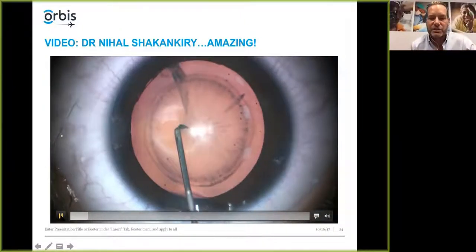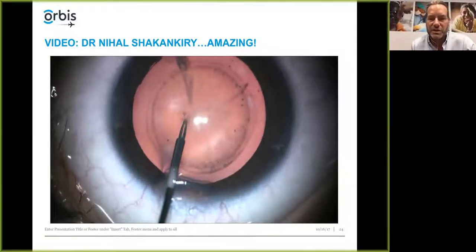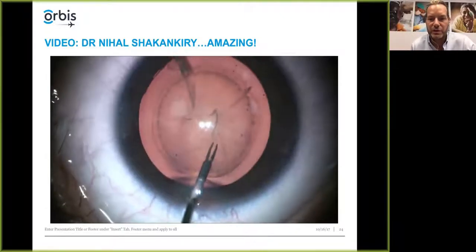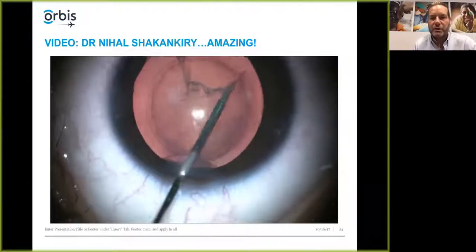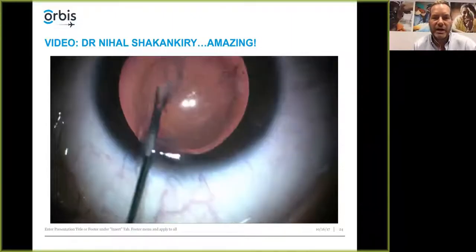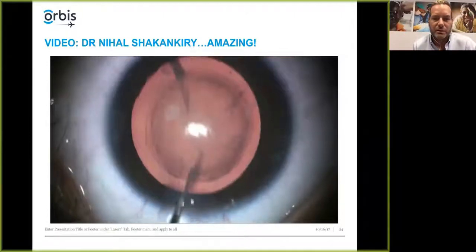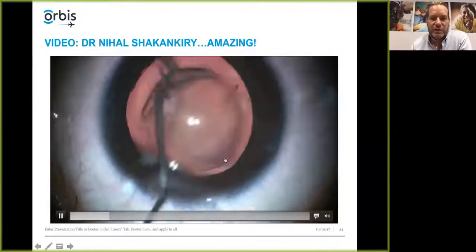All right, so I'll back up a touch. So she's got her cystotome needle, initiates her capsulorhexis, and then she's got these nice small incision forceps. And I think it's easier to do it through the larger incision, like she's got a 2.5 or 3 millimeter incision here. But I think you could do this through one of the MVR incisions as well. And she's tearing a very nice capsulotomy. And that is certainly a pro move. I like this move coming up next.